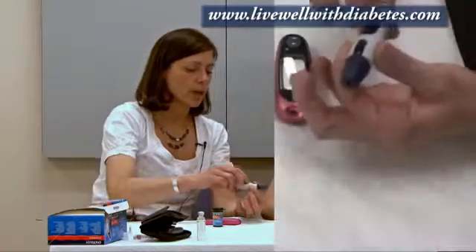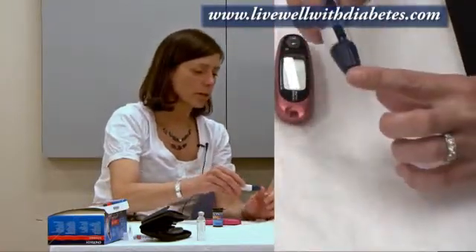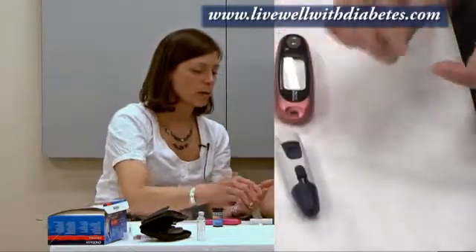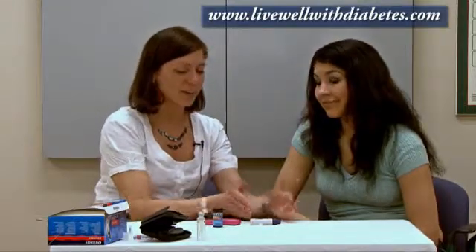Get the fingers ready, pull this down to set the spring, put the finger next to the hole, and push the button. When you push the button, it'll poke you and you'll get a drop of blood. So that's how to use the finger poker — the lancet device. Now I'm going to go over here to show you how to use the machine first.